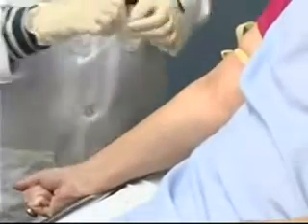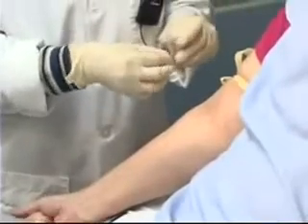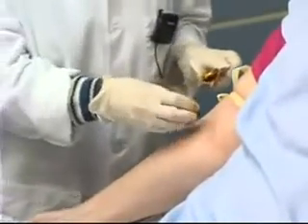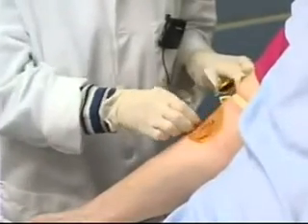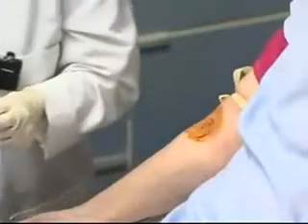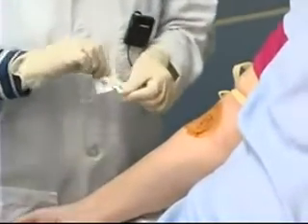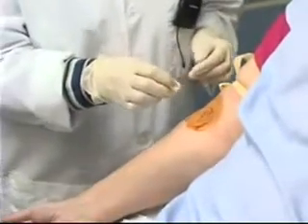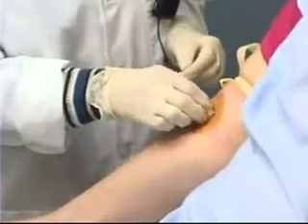I'm going to clean the area first with some povidone iodine solution, starting in the center and cleaning outwards in a circular motion, allowing that to dry. I can then clean the area again from the center and working outward in a circular motion with an alcohol swab.